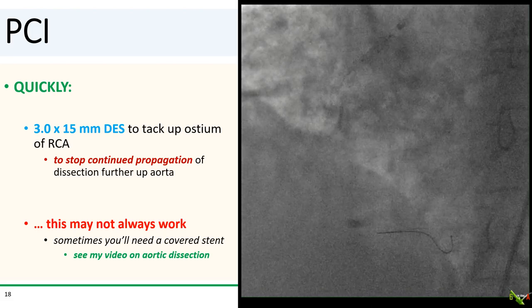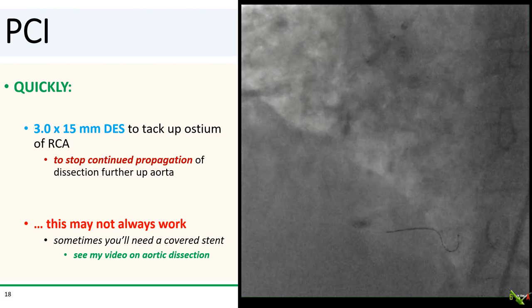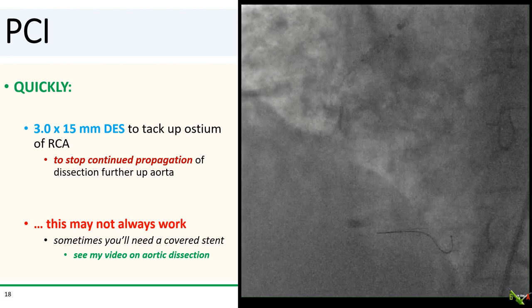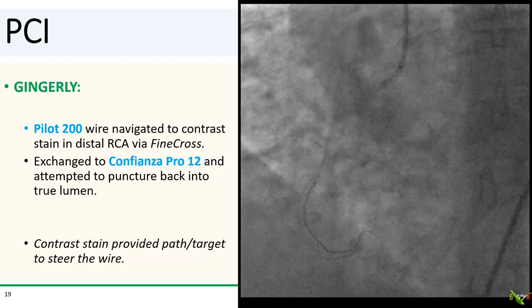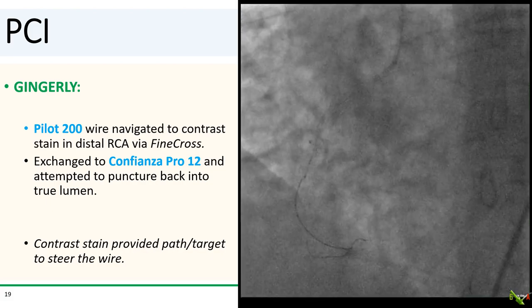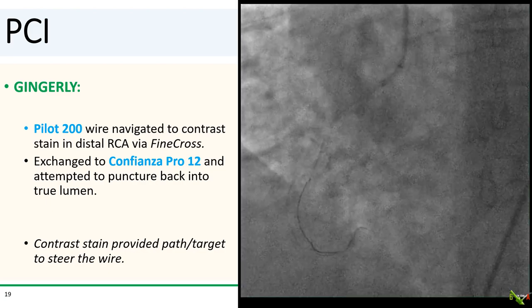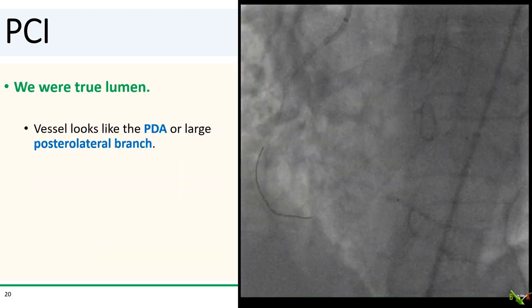So very quickly, we used a 3.0 by 15 mm DES to tack up the ostium of the RCA, to stop the continued propagation of the dissection further up the aorta. This may not always work, and sometimes you'll need a covered stent — I go over this in another video of a dramatic case of aortic dissection during an FFR procedure. We then passed the Pilot 200 wire via another fine cross catheter into the contrast stain in the distal RCA, then exchanged the Pilot 200 to a Confianza Pro 12 wire and attempted to puncture back into the true lumen. This being a community hospital, we did not have the stingray system available.